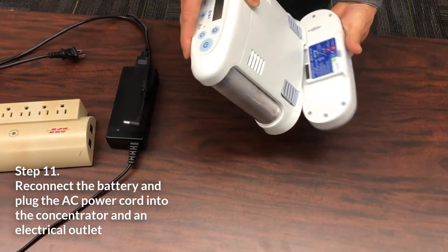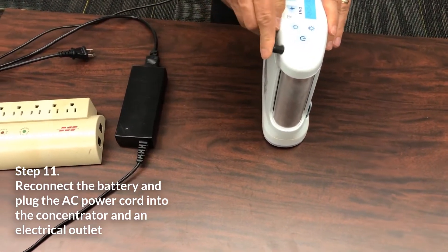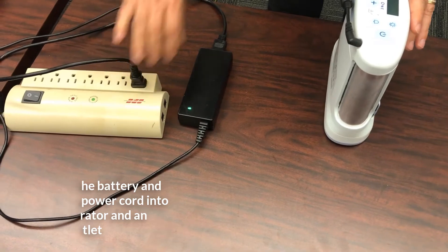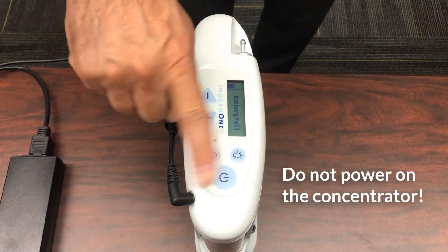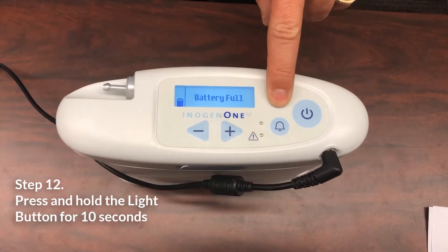Reinstall the battery. Connect the AC power supply into the concentrator and plug the other end into an electrical outlet. Do not power on the concentrator. Press and hold the light button for 10 seconds.